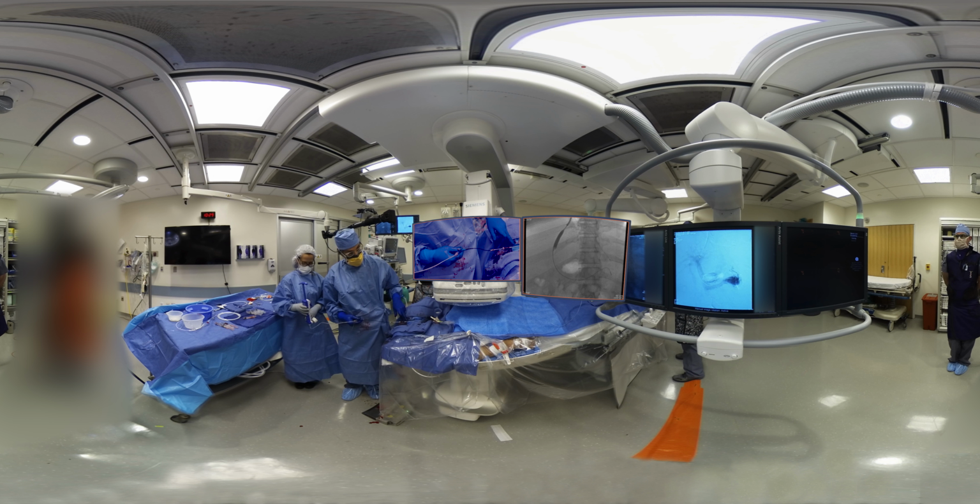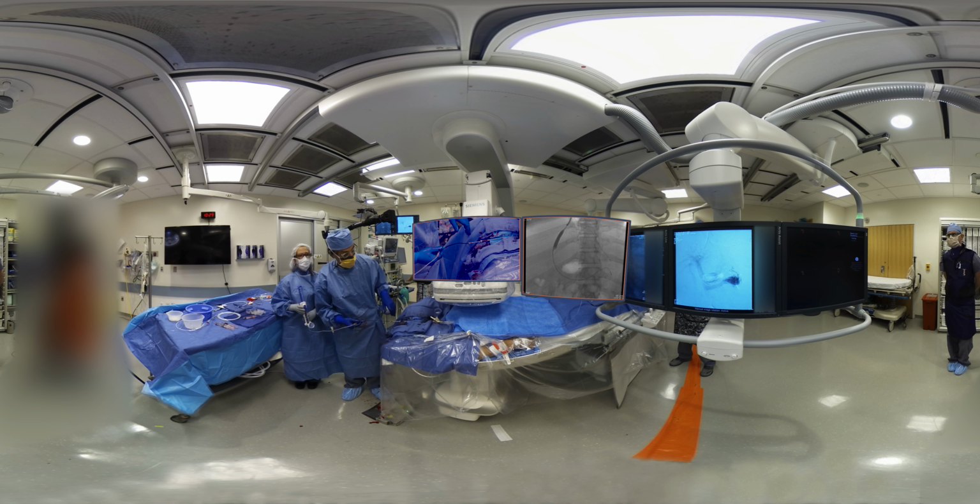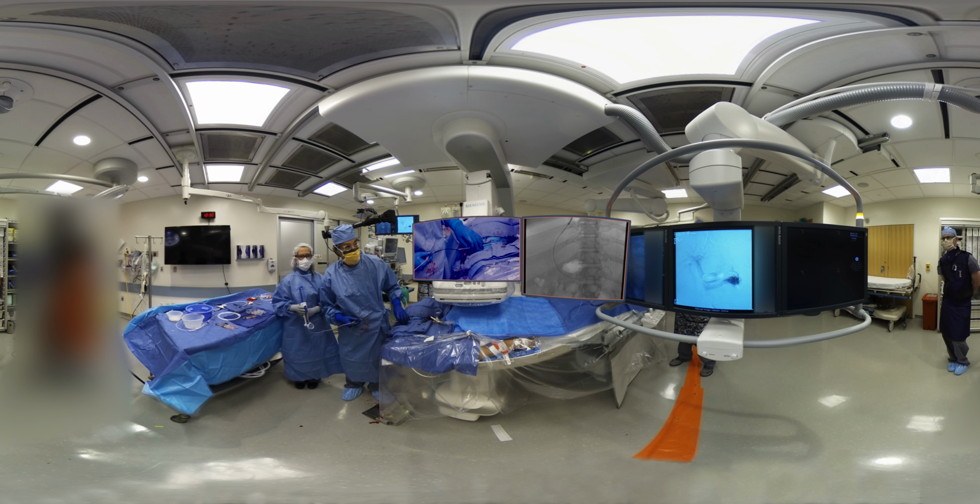So my goal now is to get the outer sheath all the way down into the portal vein, both so that we don't have a misadventure backing out our equipment and losing access, but or more importantly, because the next step is going to be measuring and delivering a stent graft, I want to assure that the sheath can move readily in and out of the tract so that there won't be any surprises when we come to device delivery.